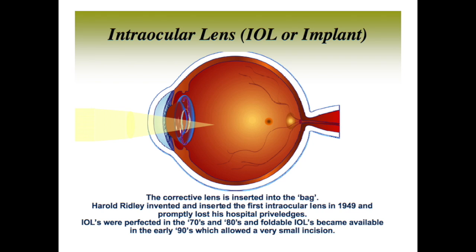When the soft plastic foldable lenses came about, we were able to maintain that small size of the incision, and so you have the invention of Dr. Ridley and Dr. Kelman coming together in fruition boldly in the 1990s.